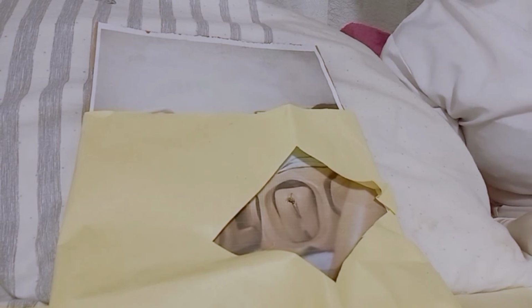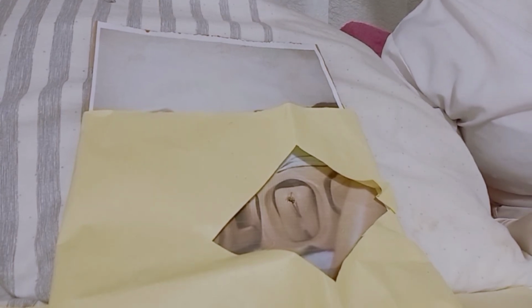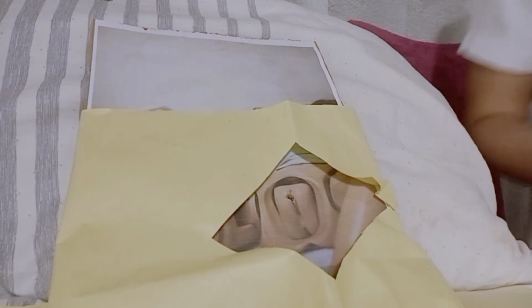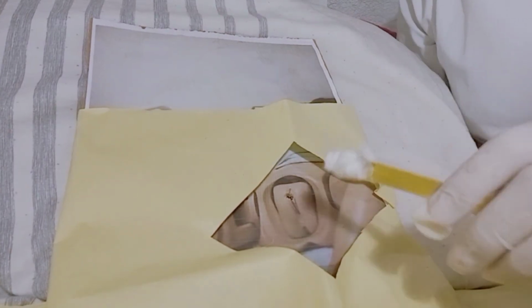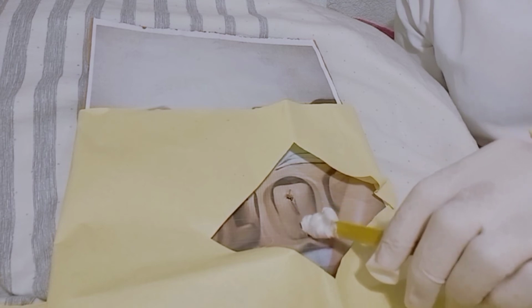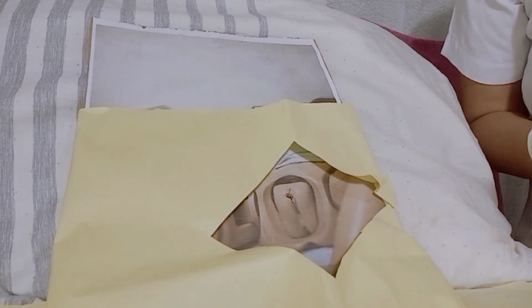Remove the fenestrated drape from the lid and place it on the perineum such that only the labia are exposed, or discard the drape if you prefer. Rationale: expands the sterile field. With the sterile forceps in your dominant hand, cleanse the meatus with cotton balls, without cross-contaminating or contaminating the sterile field.